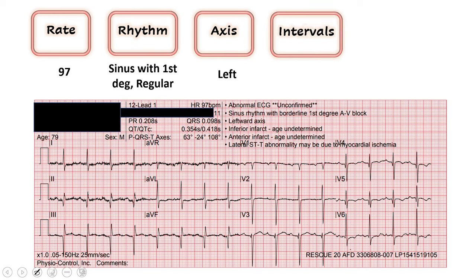As we move on to look at our intervals, the two most important ones are our QRS — we want that to be less than 120, it's at 98, we're good to go there — and then our QTc, which we find right here. It's 418, that's less than 450. We're good to go on our intervals.